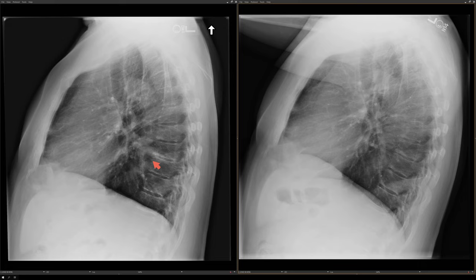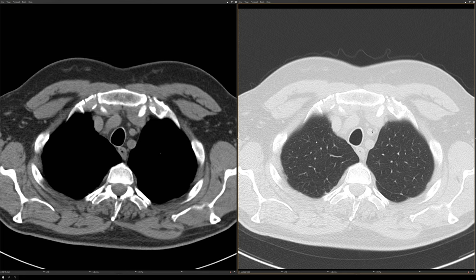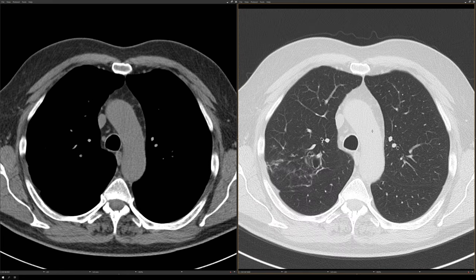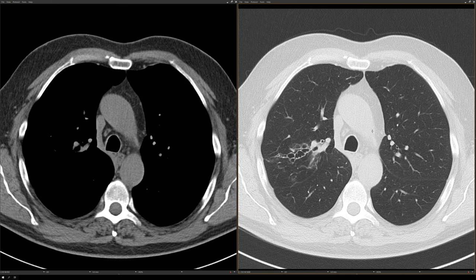I would want to get a CT at this point to further investigate. This chest CT was done a couple of days after the chest x-ray, so let's scroll through and see what we can find. That area of reticulation that we suspected was bronchiectasis is indeed bronchiectasis, which you can see here in the right upper lobe. One thing to note is that this bronchiectasis is in the middle part of the lung — not in the lung periphery, and not all the way towards the hilum.